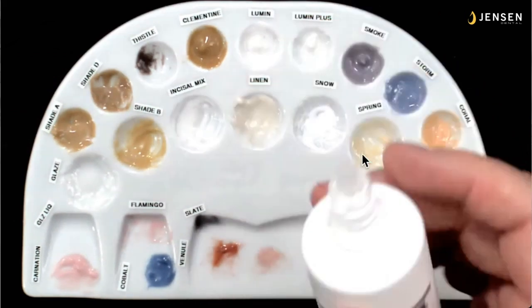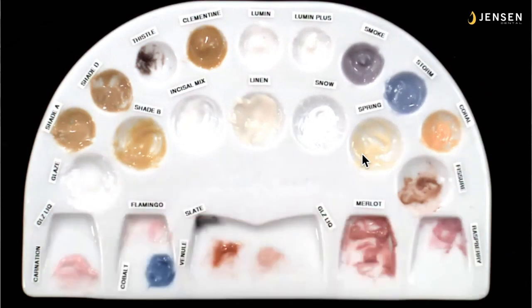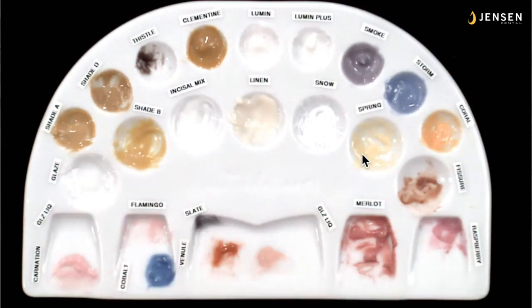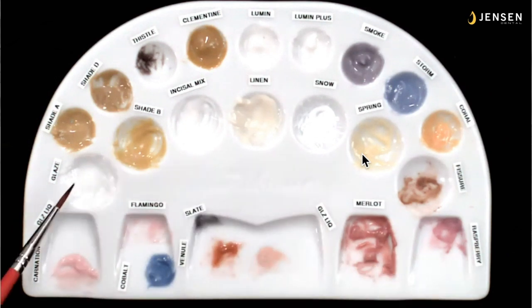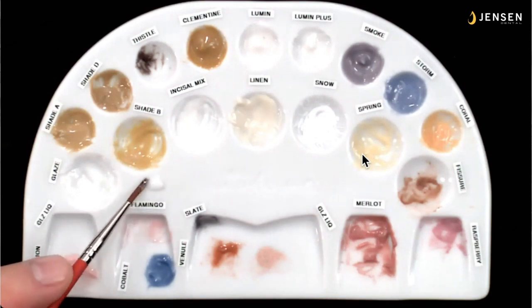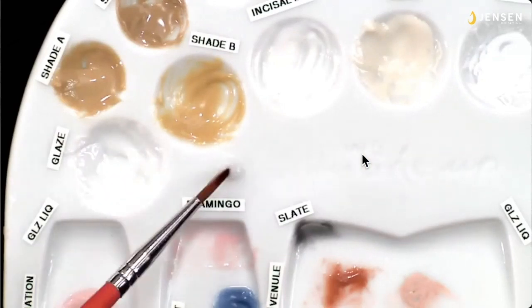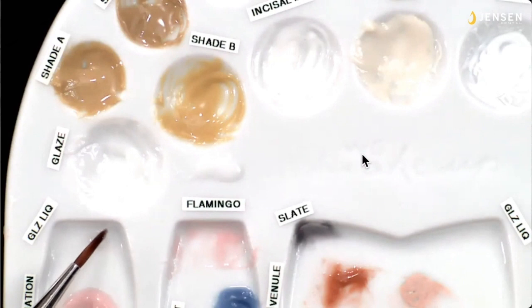I want you to use the InSync glaze liquid because if you use a high fusing liquid, when it fires, it'll be kind of a smoky battleship gray. Use a number 1 brush. Number 1 brush is about the same size brush as you'll see in a nail polish dispenser. I get a little glaze liquid in it, and I'll dispense some of the paste glaze on a flat surface. Now your paste glaze is going to be about the consistency of a thick honey, and that's going to be a little bit too thick to apply easily.